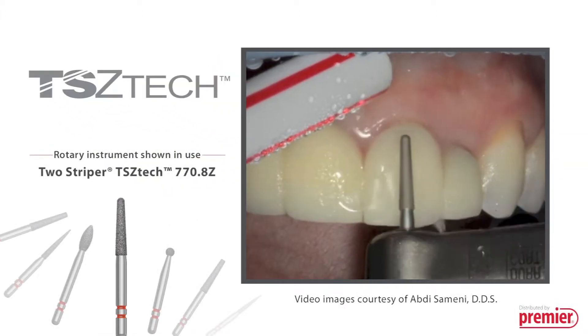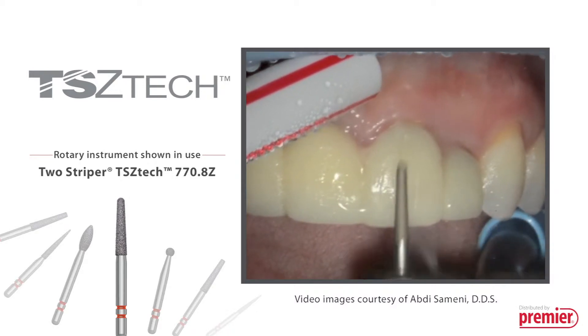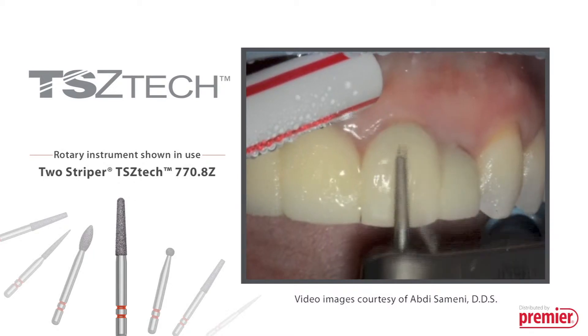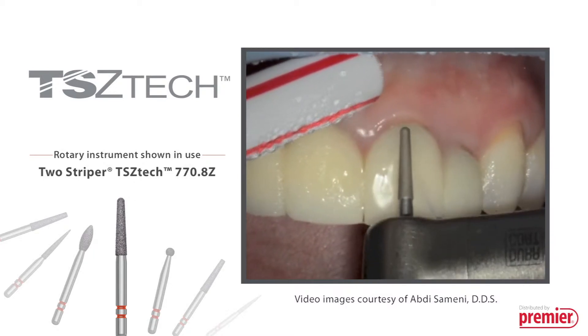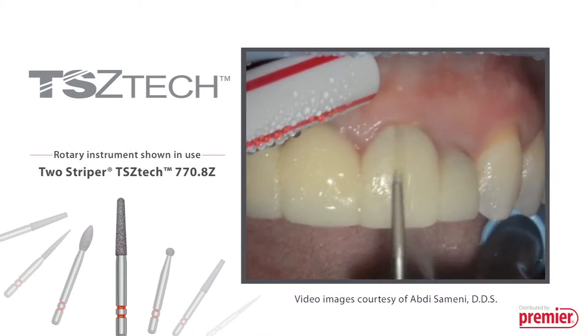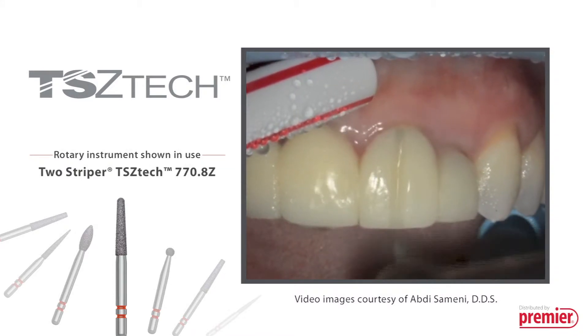Two Striper TS Zetac Diamonds: advanced technology for advanced dentistry. Two Striper TS Zetac Diamonds are uniquely designed for crown removal and finishing of all ceramics, including zirconia and lithium disilicate.